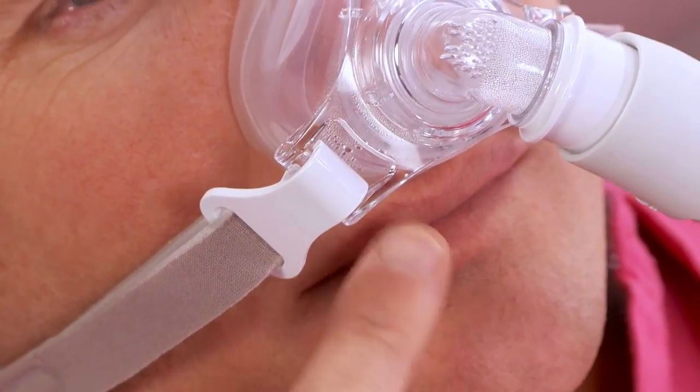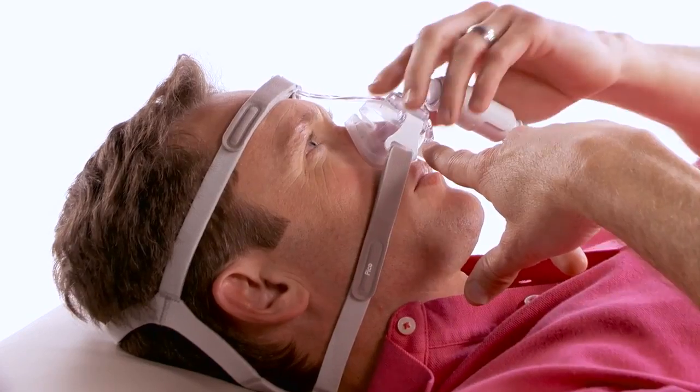If air is leaking onto the top of your lip, adjust the bottom headgear straps.